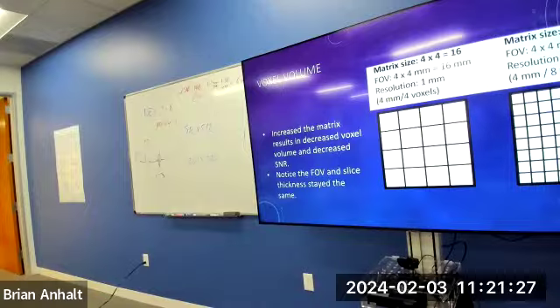And then we're collecting data points, however many we need to create as many voxels as we want. And then we collect different echoes with a different amount of phase shift, which equals our lines of K-space to give us our resolution in the phase direction. So when we're looking at a 512 by 512, that means there are 512 echoes that need to be collected with different amounts of phase shift. That'll be our phase direction and our frequency direction. Every echo we collect is going to have 512 data points with different frequencies because we apply that gradient.